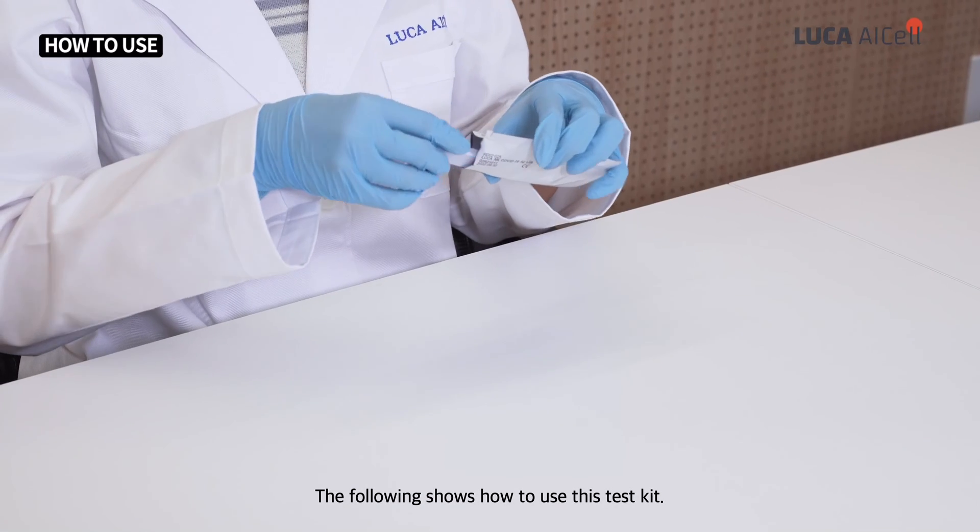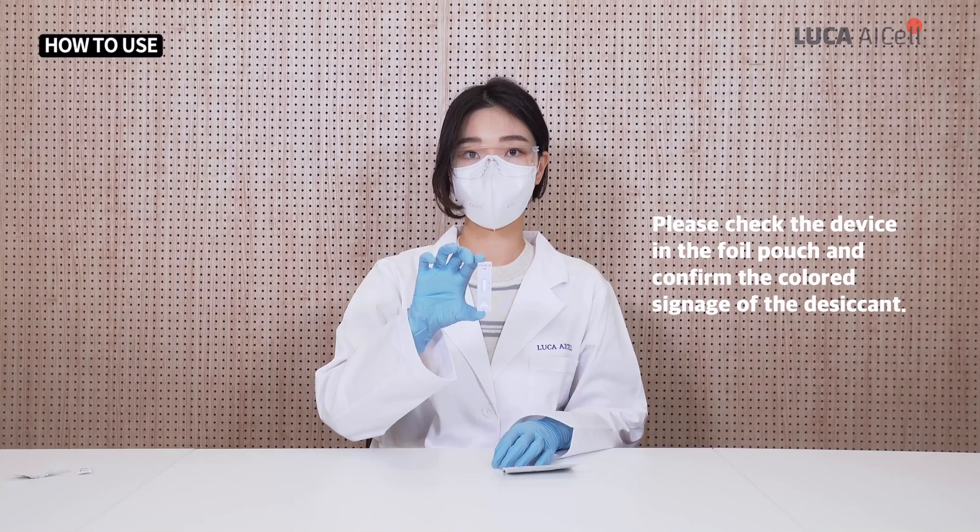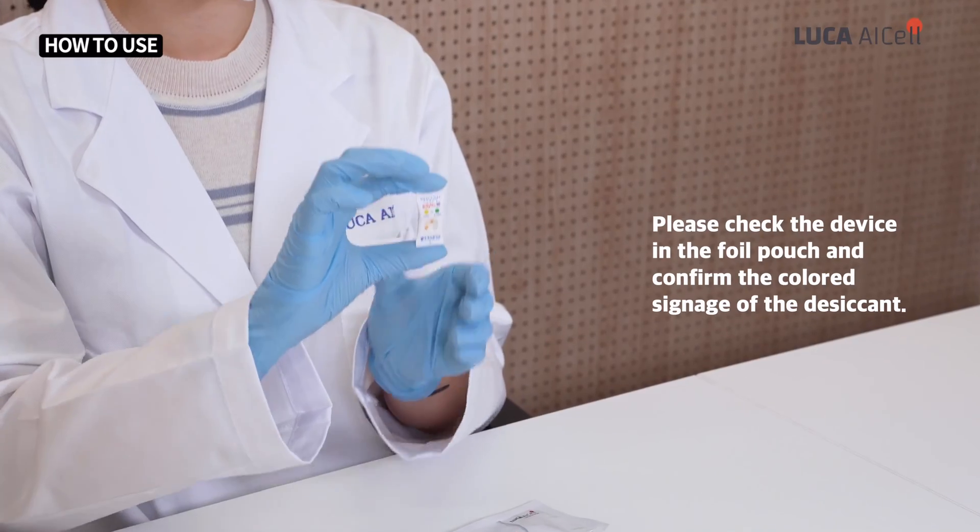The following shows how to use this test kit. Please check the device in the foil pouch and confirm the colored signage of the desiccant.